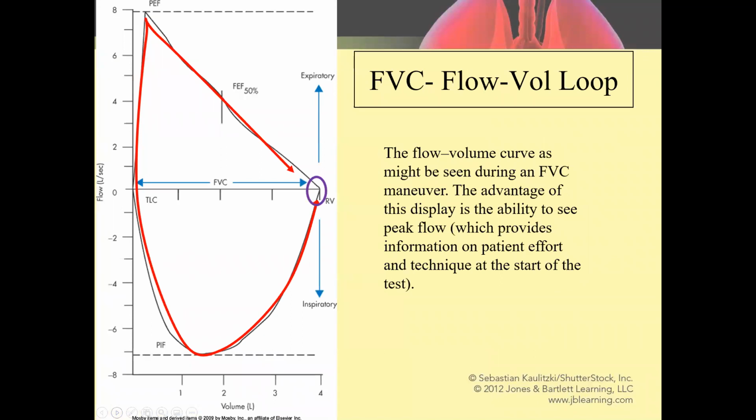And then the infamous flow volume loop, which again is producible from a lot of the bedside digital devices. They will actually show you the display, not just in the computer, but the actual device itself will probably show you a flow volume loop. The lower portion of it is the inspiration, the upper portion is the expiration. And this is closer to a textbook demonstration of what you'd see in a relatively normal flow volume loop, the shape of this. I say that because we'll look at a few that are classic but abnormal.